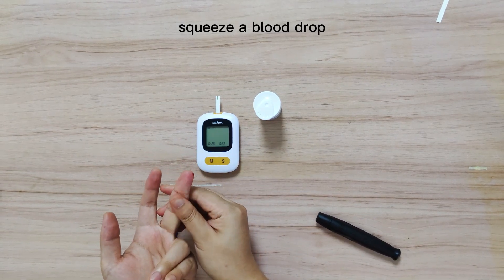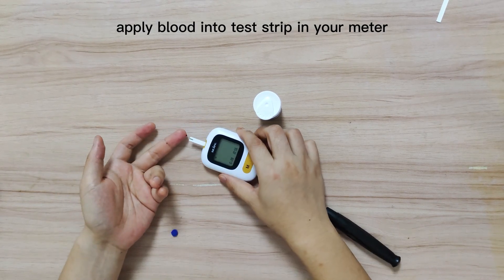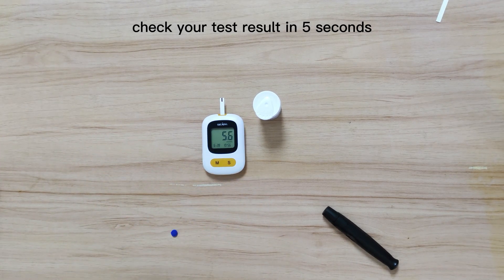Gently squeeze your finger until one small drop of blood is visible. Apply the blood drop into the channel of the test strip until the channel is fully filled. Wait for 5 seconds to check your blood glucose test result along with the date and time of the test.